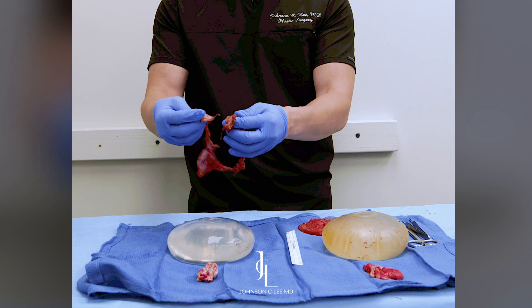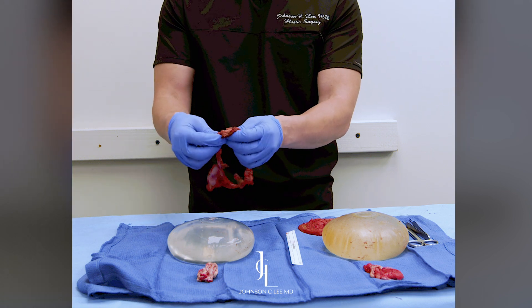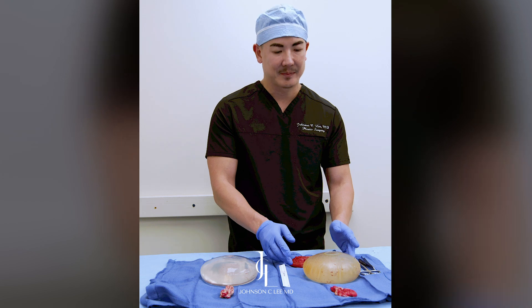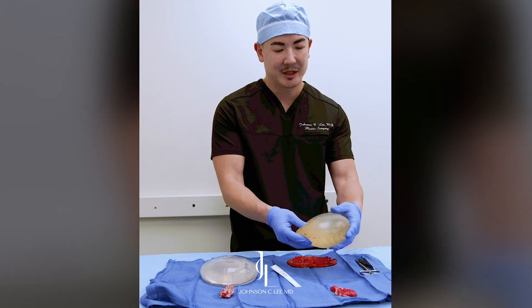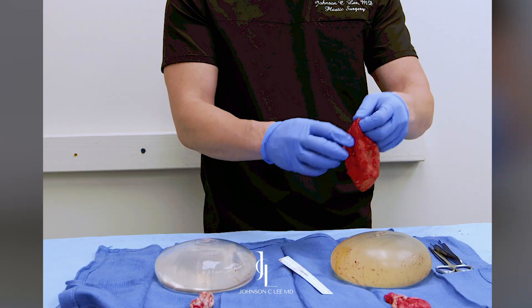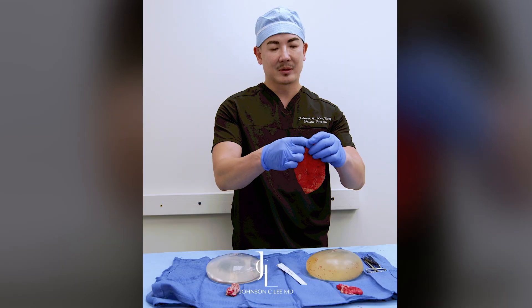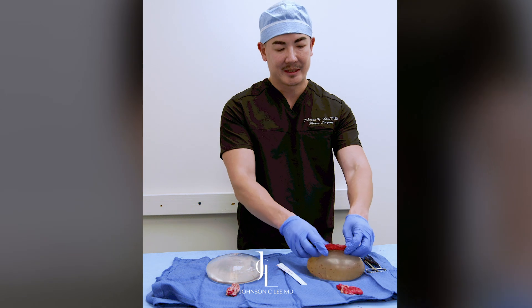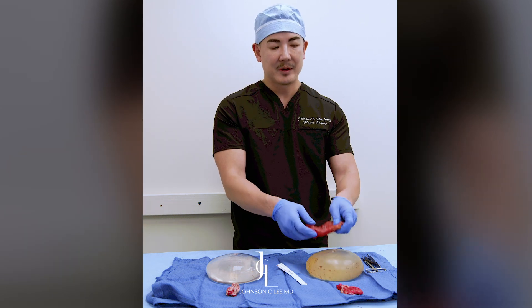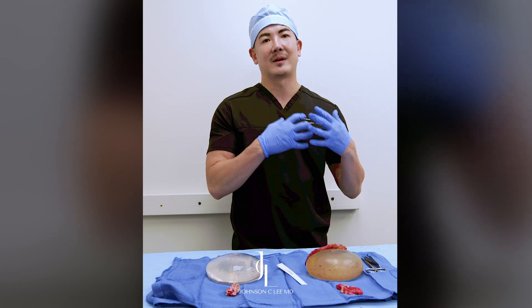The capsule comes out in little pieces — it's a little bit more of a softer type of scar tissue. And then on the side where she had a very severe capsule, the implant clearly has some type of contamination which was causing inflammation and irritation to the body. The body ends up making this very thick capsule of scar tissue that encompasses the entire implant. Because the scar tissue is so thick and firm, you're going to notice that the implant itself is very firm on the chest.